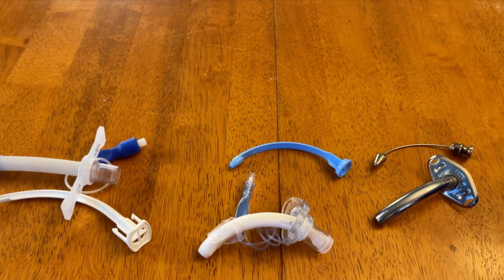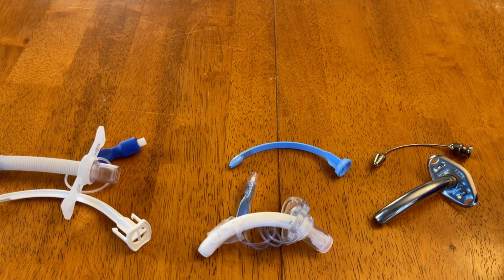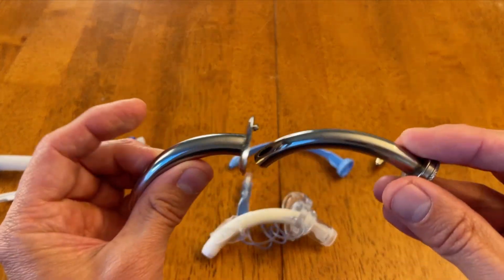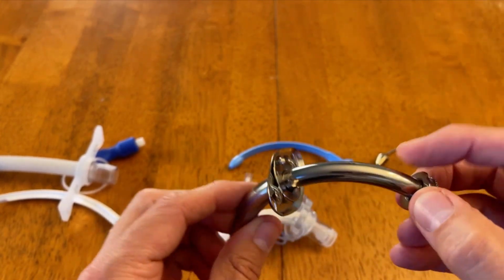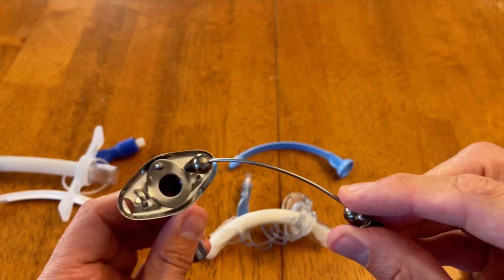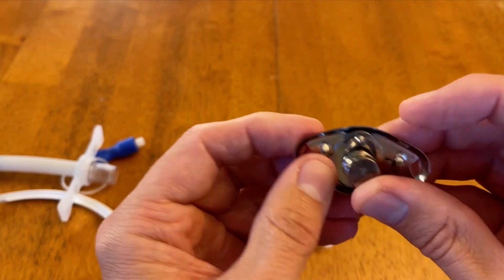And lastly, I just wanted to give an example. I have this metal one over here, a Jackson. I just don't see these very often nowadays, but it's still possible. You may see it, and you can tell that this one also has an inner cannula. It goes in like that. And then I have, of course, the obturator for insertion. It just goes inside to facilitate passage of this one as well.